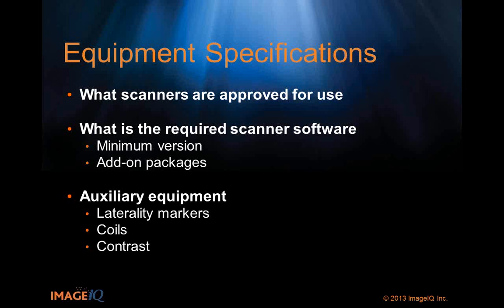And just as an example, a current study that we're doing actually touches on all of these. It's an MRI study, a cartilage study that's looking at damage. It's a replacement for damaged cartilage. It's an autologous implant, and they're putting it into the knees of patients after a sports-related injury. So we had gone through the process of actually approving devices or scanner vendors that will be useful for this study, because we required a specific T2 mapping sequence to assess damage or healing of the implant.